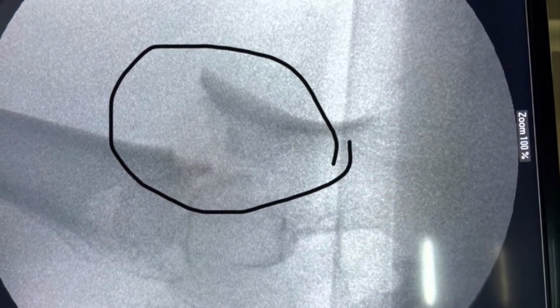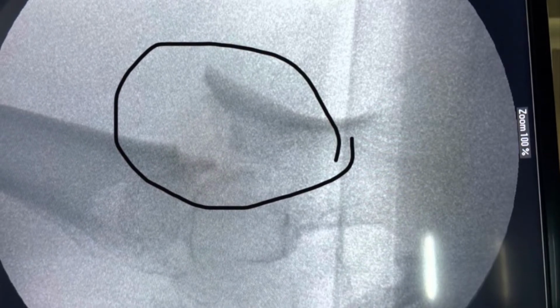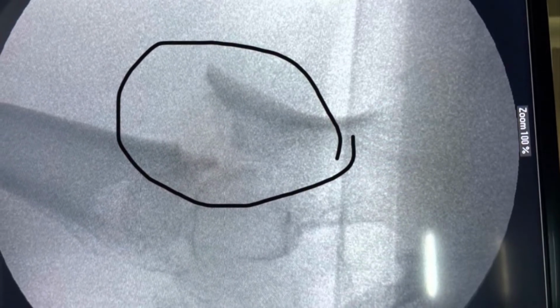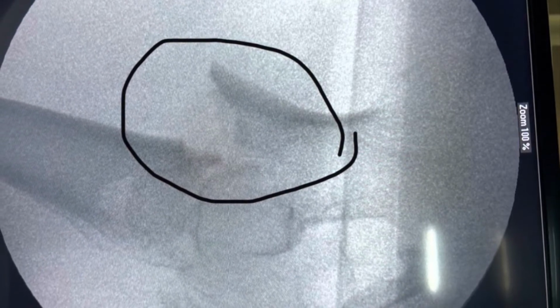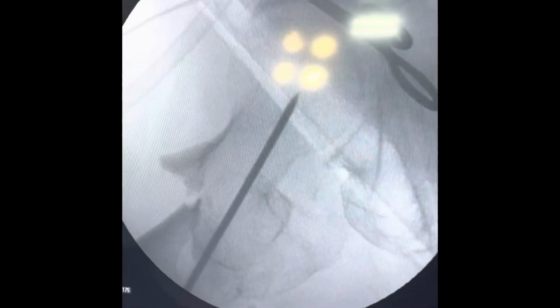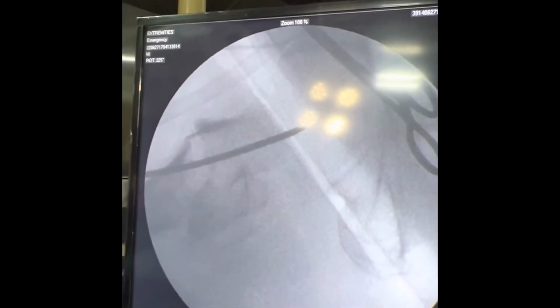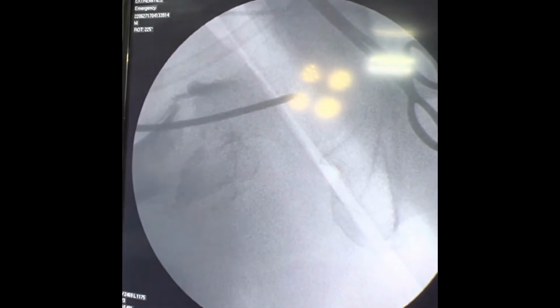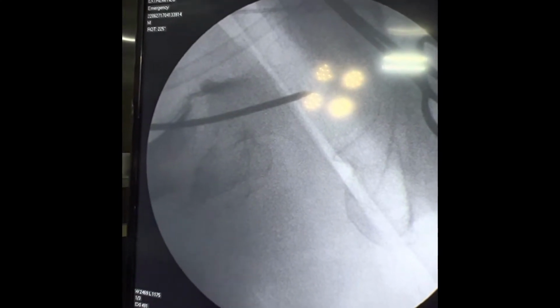This is the externally rotated neck of femur. External rotators are attached to the proximal fragment, which rotates the proximal fragment externally. Correction of external rotation is more tricky. Here we have used two techniques. One is passing a K-wire along the displaced proximal fragment and then internally rotating using it as a lever.